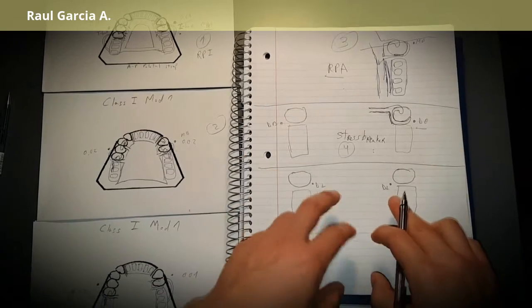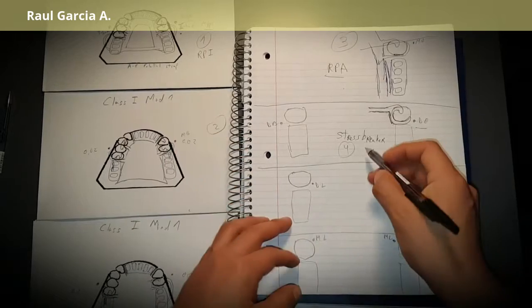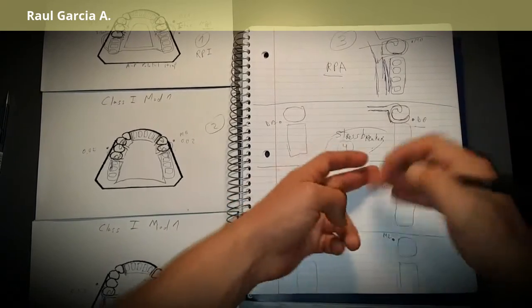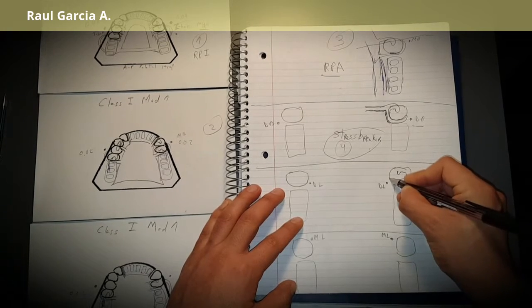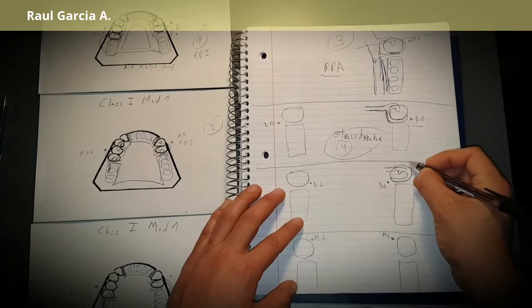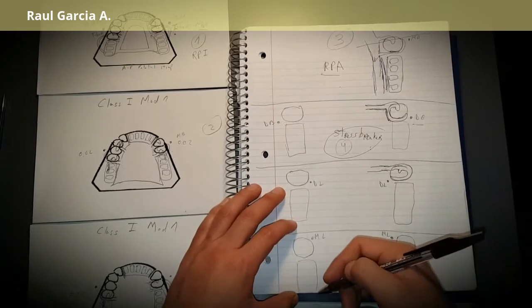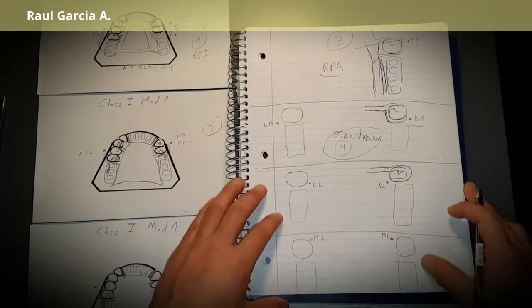If you have a distal lingual undercut, use a stress breaker and put your back-action clasp vice versa — the rest comes here, the retentive arm comes here, with the guiding plane and rest continuing through the structure with a long minor connector.